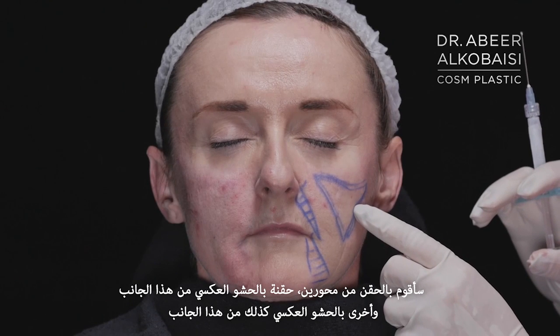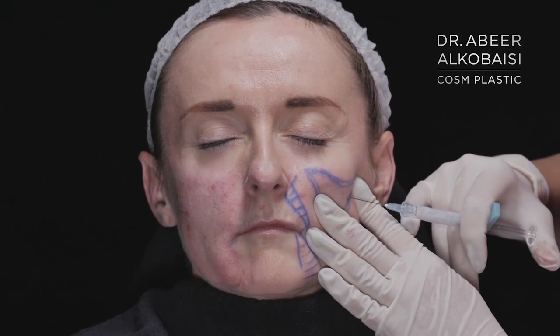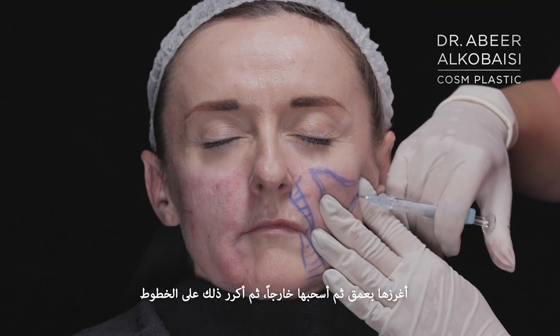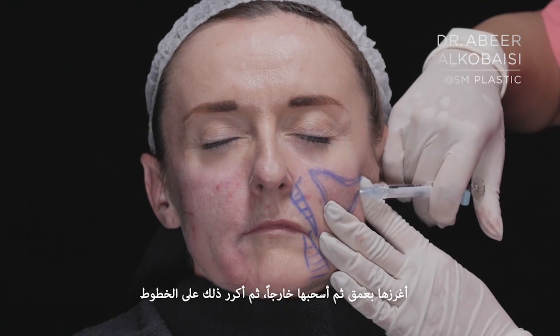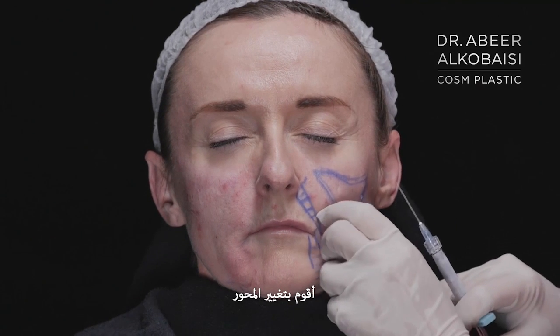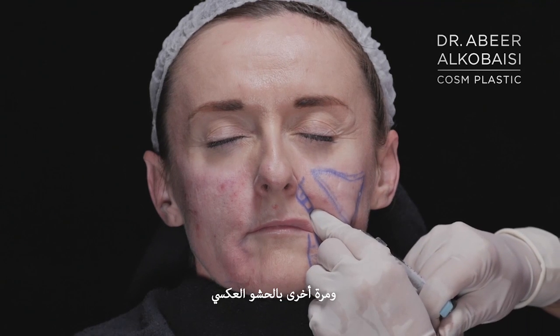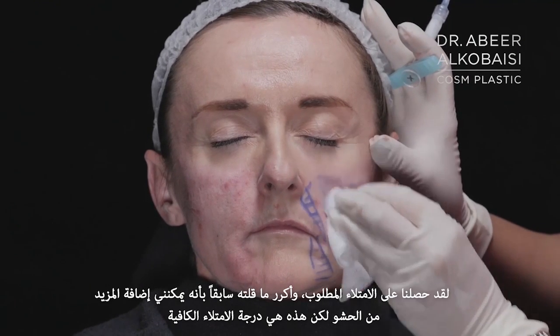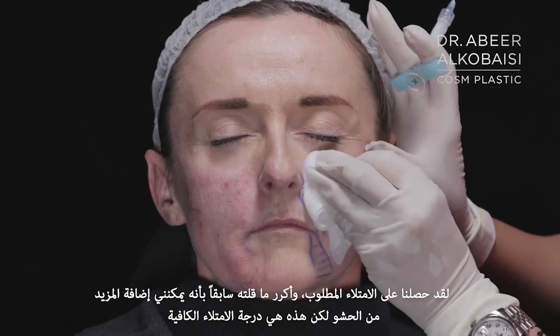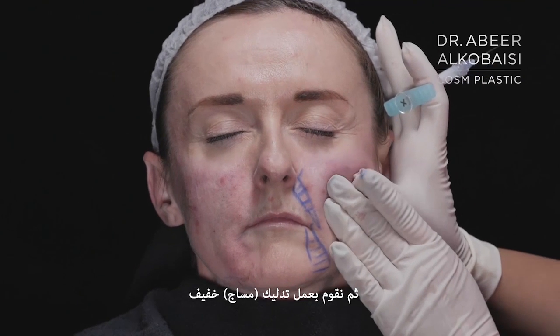I'm going to get into this triangle from two axes, a retrograde from this side, and again a retrograde from this side. So I go deep and I come out, and again in lines. I change the axis, and again retrograde. And that's it. The volume has been restored, and I repeat, I can still keep more, but that just give it a fullness of the depth. Voila, done. Then a little massage.